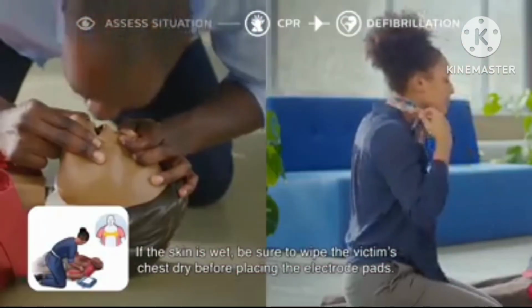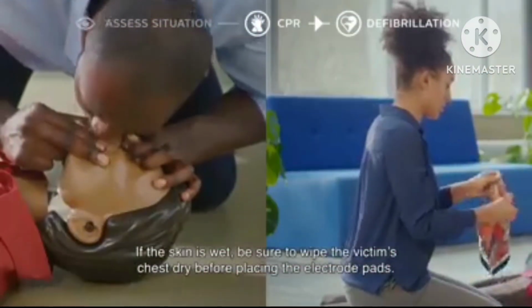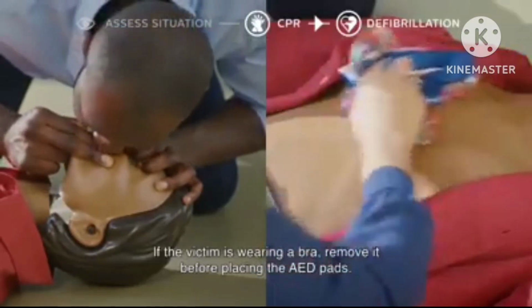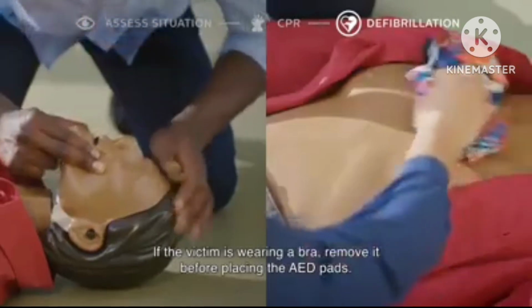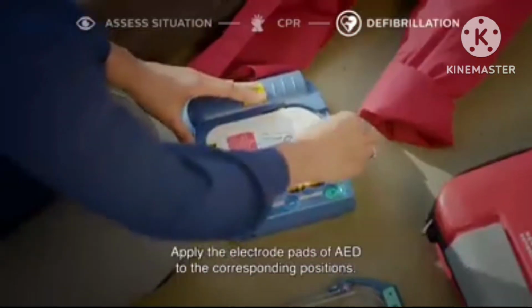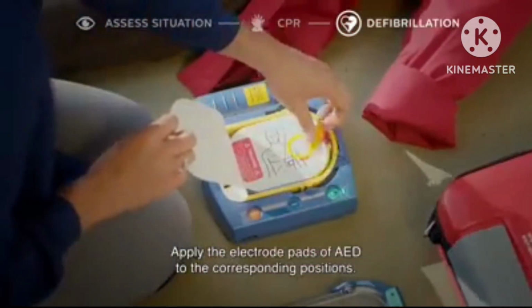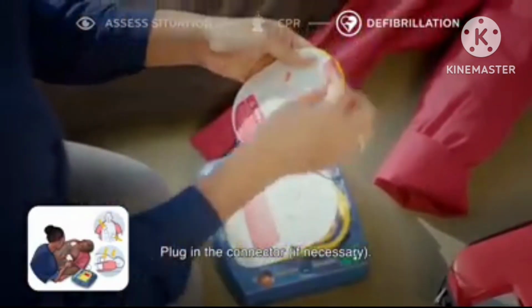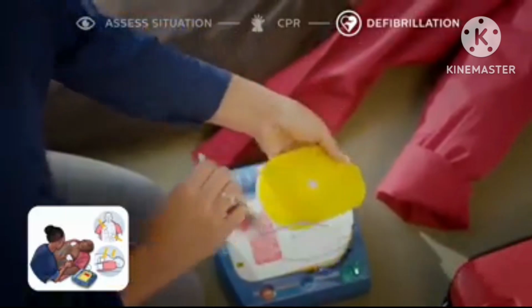If the skin is wet, be sure to wipe the victim's chest dry before placing the electrode pads. If the victim is wearing a bra, remove it before placing the AED pads. Apply the electrode pads of the AED to the corresponding positions. Plug in the connector if necessary.